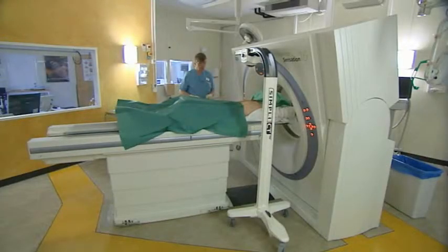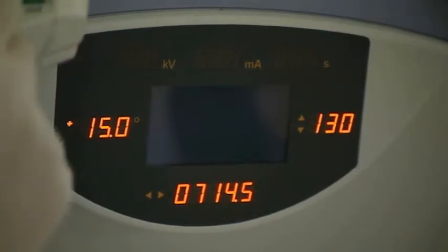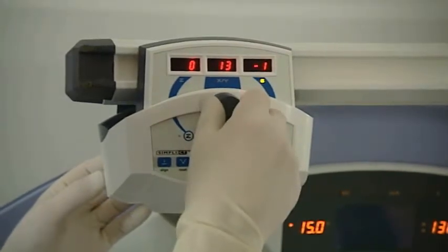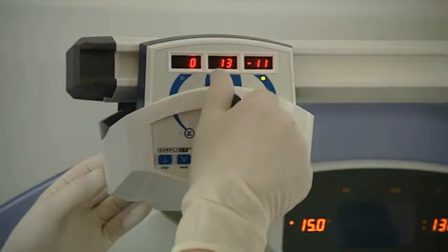If double angulations are necessary, simply dial in the corresponding gantry or cranial caudal angulation. This is done by pressing the G button and turning the angle input wheel until the angle of the SimpliCT matches the angle of the gantry tilt. Make sure the cranial caudal orientation is correct.